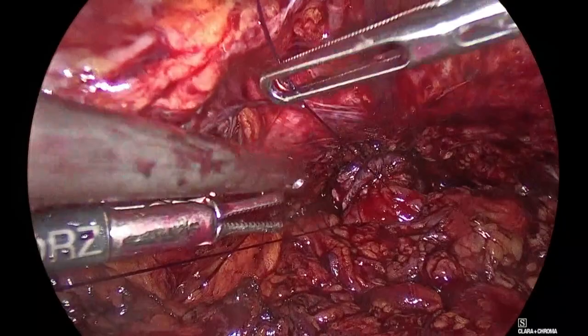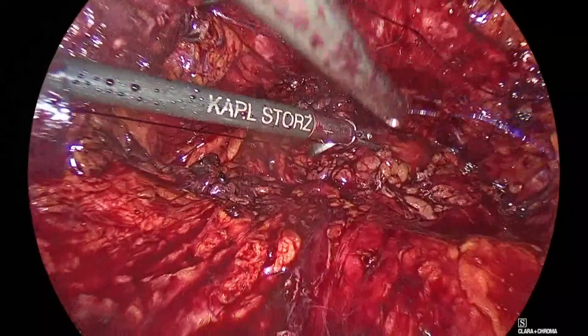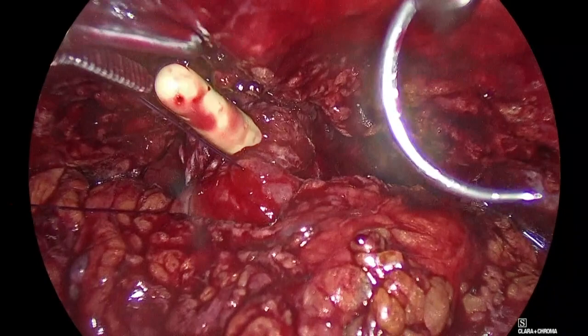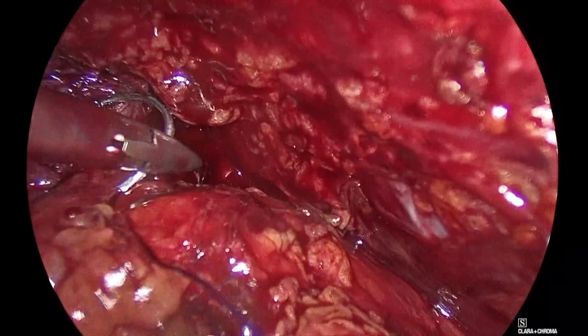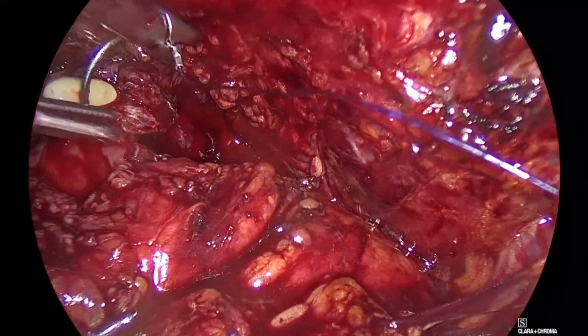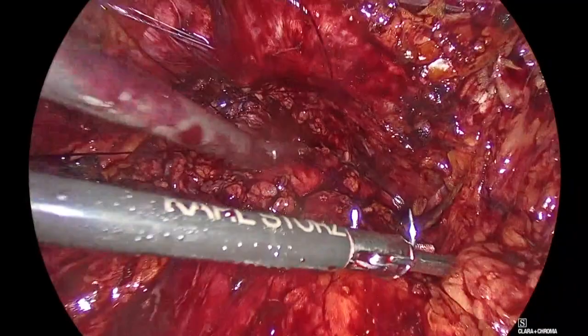I like the PDS a lot. It slides down very nicely. PDS is not good for knot tying, but for all the rest, for sliding stuff, it's extremely nice. It's a strong suture. Good. Right side, by the way. Come in, show me. Good. Very nice. Good. Go back. Panagiotis, leave it. Leave it. Leave it.